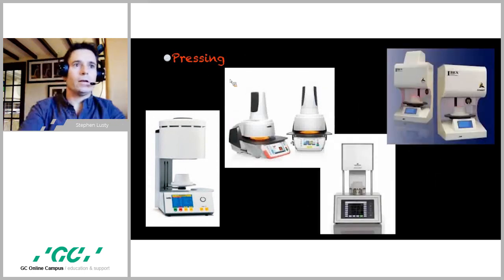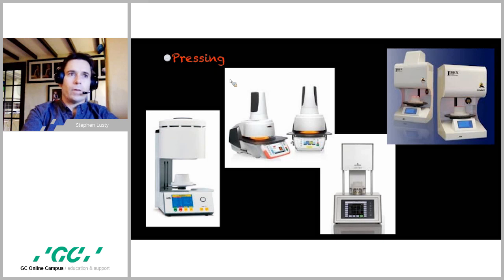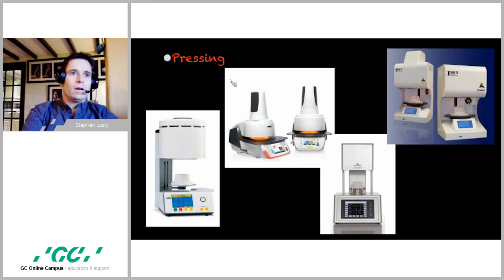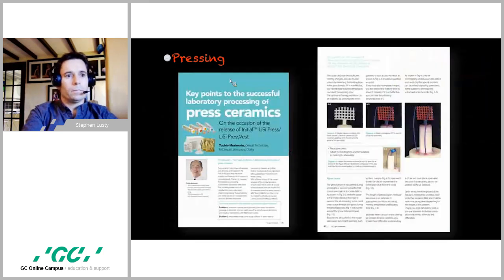So pressing is where your experience and knowledge really needs to kick in. It's the same as your firing parameters. I can give you the parameters that I use, but you need to apply logic to it, as there are many furnaces on the market. These all fire differently, and even furnaces of the same brand can be calibrated differently. I've been told that the Zubler furnaces now come with the program pre-installed, but in general, I think that the hold time in the manual is too long. I've reduced my hold time to 15 minutes, and if you're finding that your pressings are short, try increasing the temperature, but do this slowly. If you're getting a reaction layer, reduce temperature. Again, do this a little bit at a time.